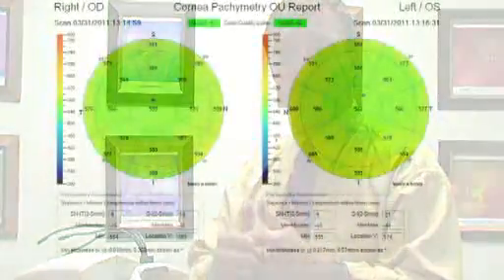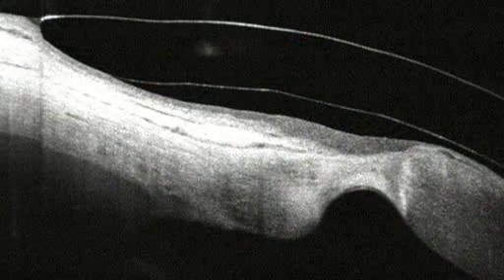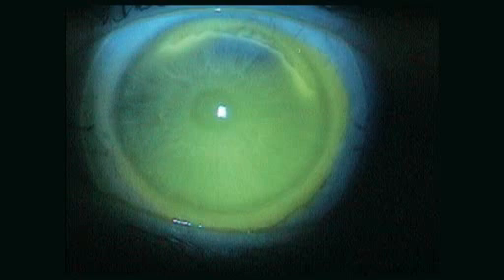I have been very aggressive in looking at what's in front of the cornea, or contact lenses, and looking at the effect certain contact lenses have on the eye and the fitting of contact lenses to the eye. There is a growing interest in use of the OCT to evaluate rigid gas permeable contact lenses on the eyes: cornea, corneoscleral, semiscleral, and scleral lenses, all these different lens sizes that we use and fit on the eye to afford people great vision for healthy eyes and to remediate problems when there's unhealthy eyes. I'll show you a few little side videos on what we do and how we evaluate the fit of contact lenses on the eyes.